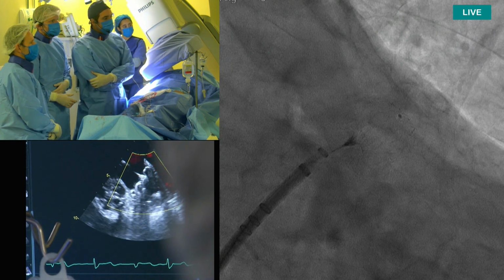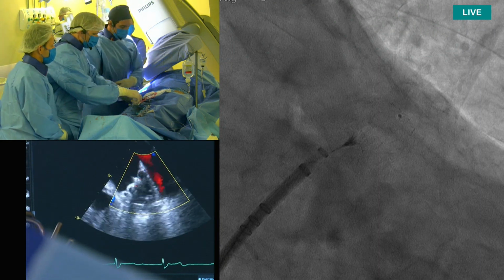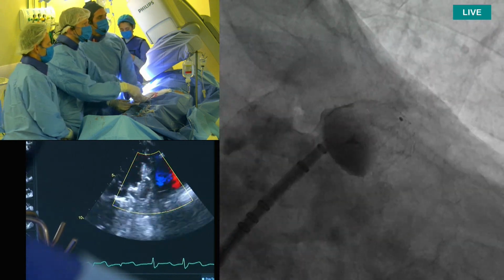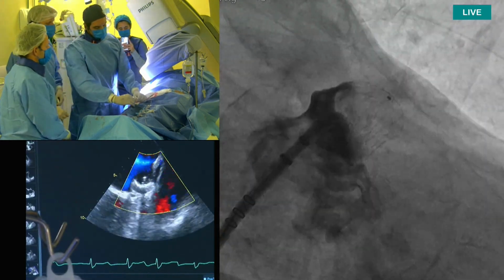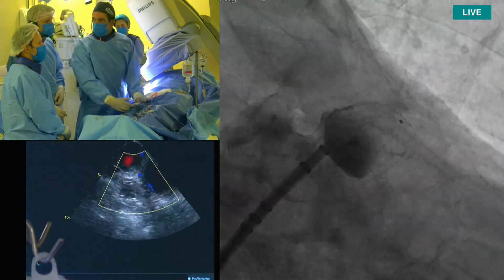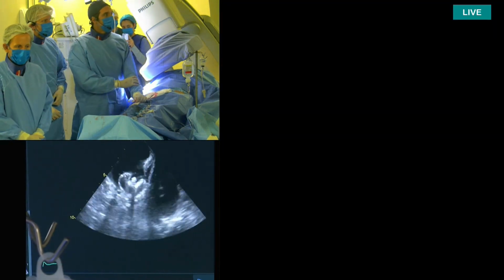Fábio, Felipe, and Ole, we still have 1 minute, so if you want to summarize. Okay, so let's release the valve. So let's do a final angio and then we can do it. Yeah, all right. And then that's perfect. And now we can go for the final. You have to probably open it still. And then, okay, let's go for the final release, and then we're done. Angel, I have fluoro here. Fluoro, please. I'm out of fluoro. Yeah, now it works.